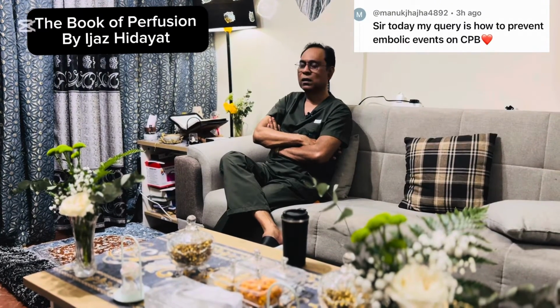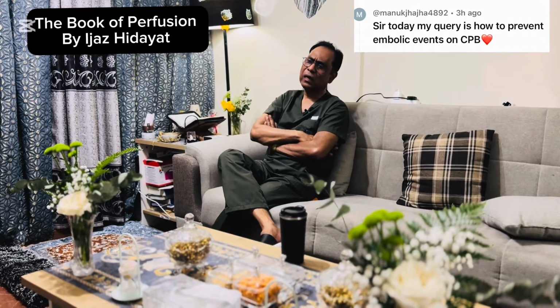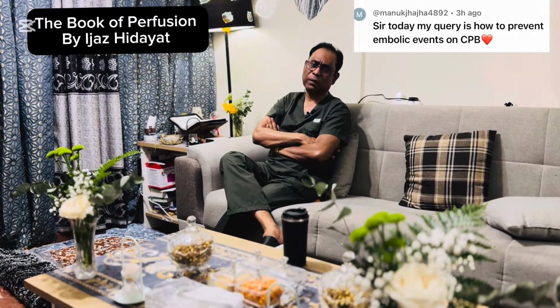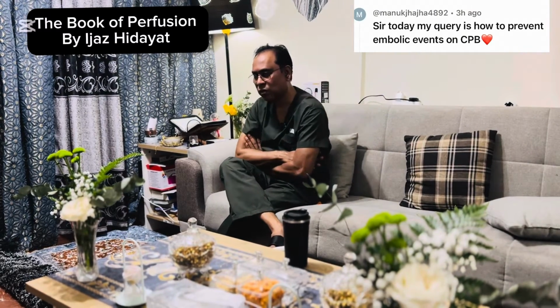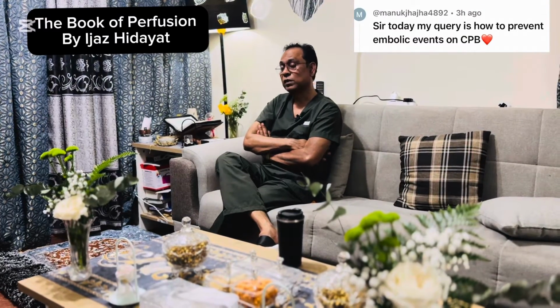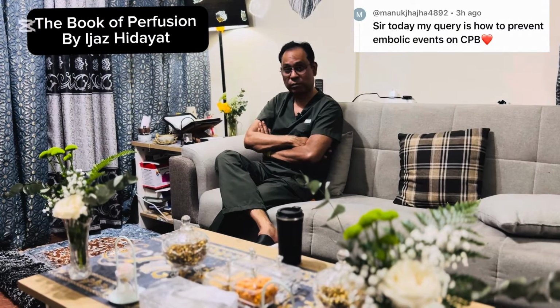Number two, you have a bubble detector, so you always place the bubble detector after the cardiotomy reservoir. So your second defensive safety measure is the bubble detector. If the bubble sensor senses a huge bubble in the circuit, the machine will automatically go into intervention mode. The machine will stop, so we can intervene in the situation of air embolism.